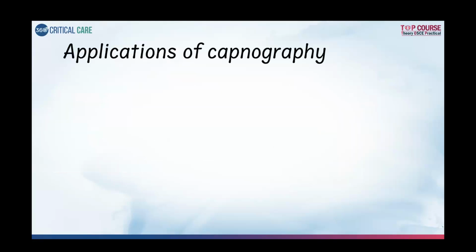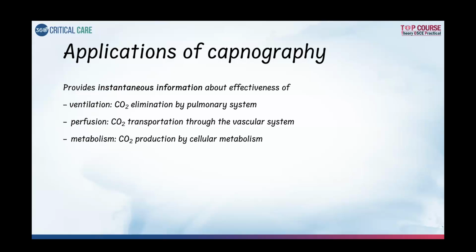What they ask in the exam is the waveform difference, and how you predict a pathology based on the capnography waveform. First of all, capnography as such provides instantaneous information about effectiveness of ventilation, perfusion, and metabolism.